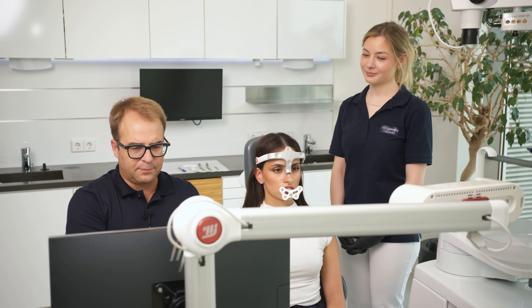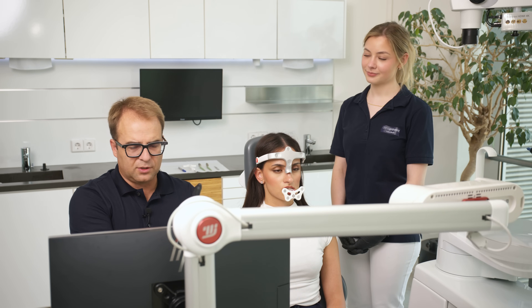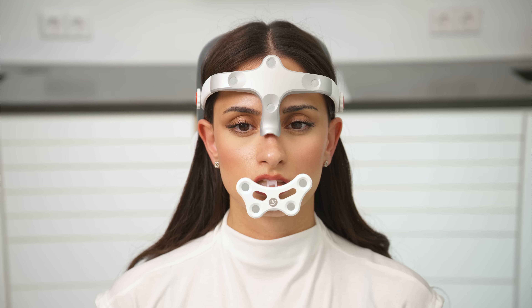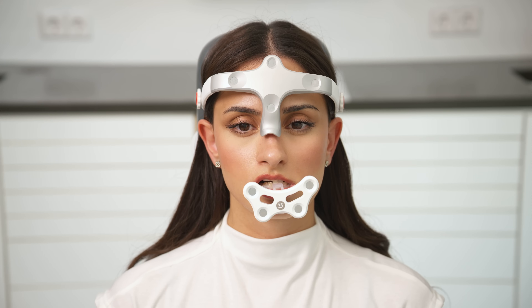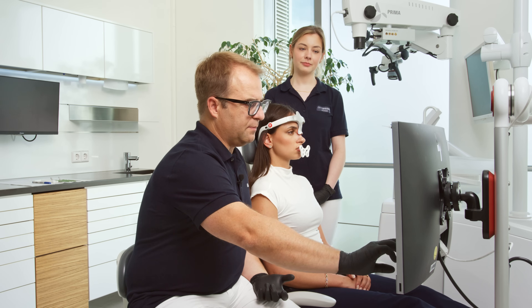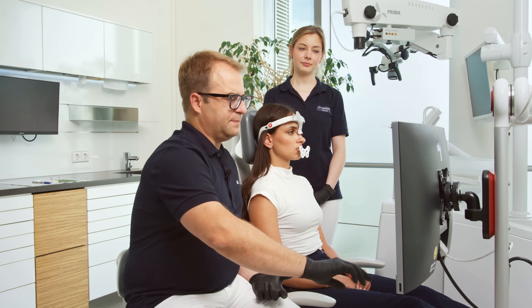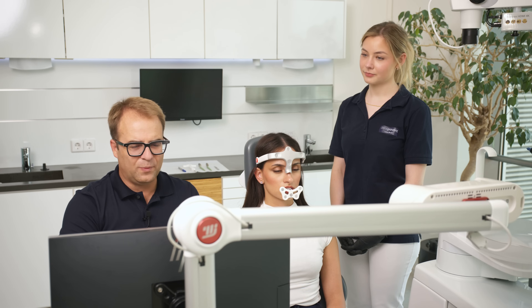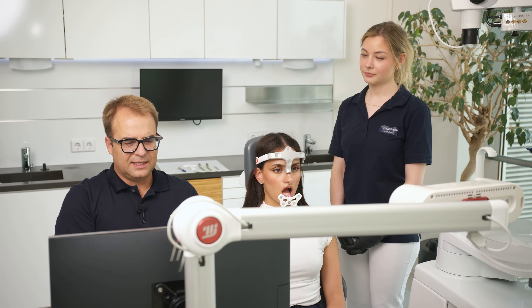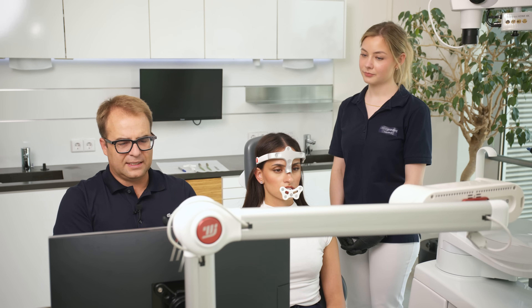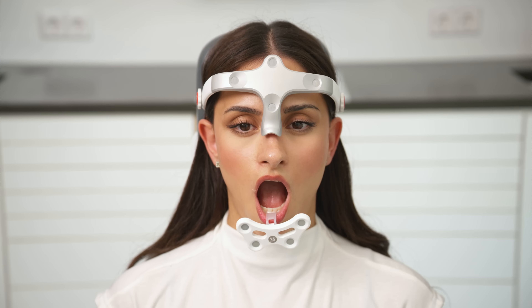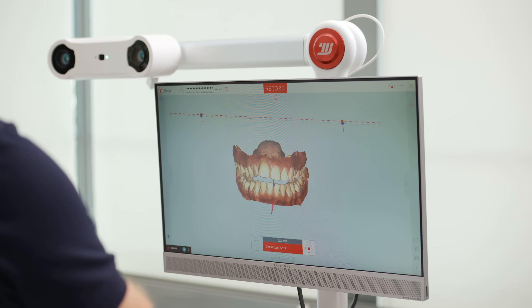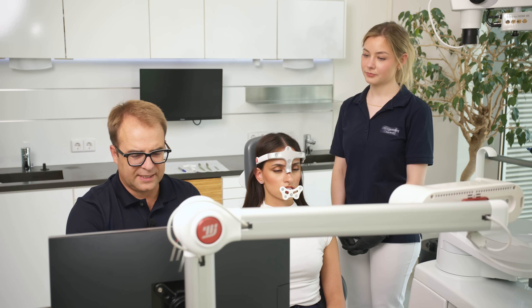Now we go to the left side. The patient moves the jaw to the left, a little bit farther, then stops. Next is the open-close recording — the patient opens and closes several times until we have a clean capture.